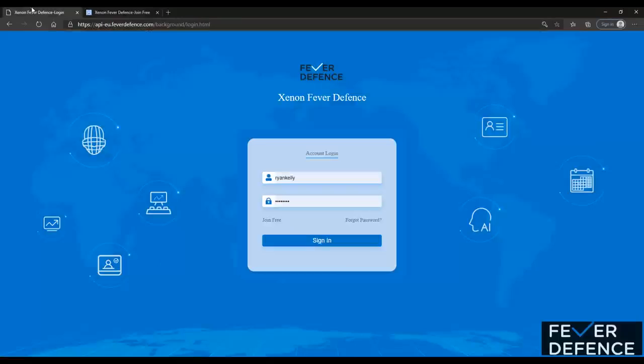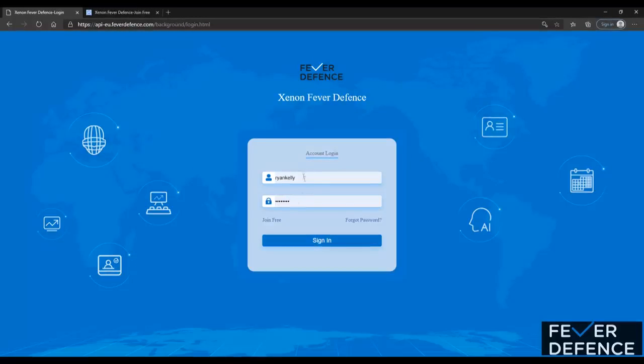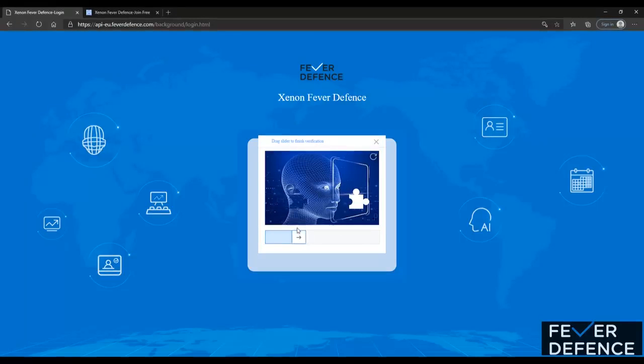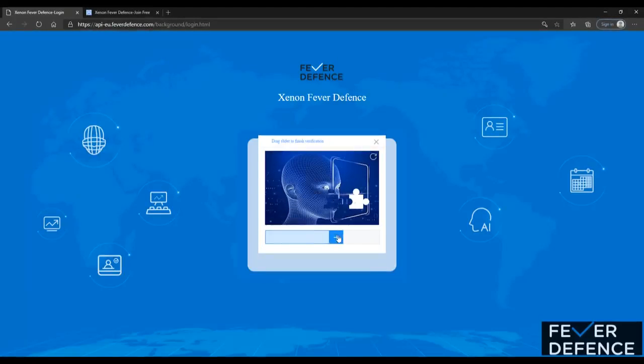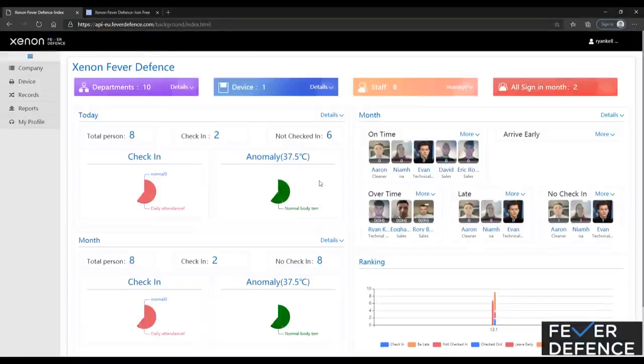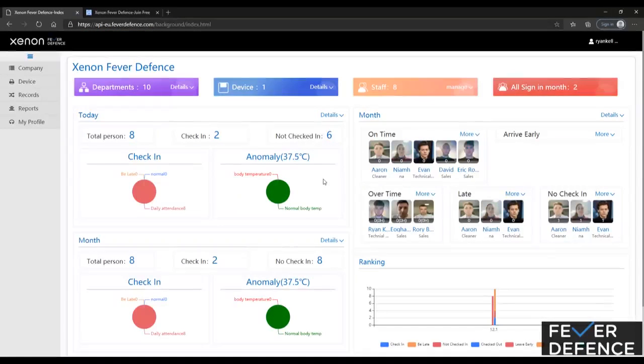From there we're going to go back to our website and input your username and password. When you've done that, you're going to click sign in and you're going to move the arrow to the right hand side. As you can see that jigsaw puzzle is moving. The objective is to put it into the puzzle. Complete that puzzle.